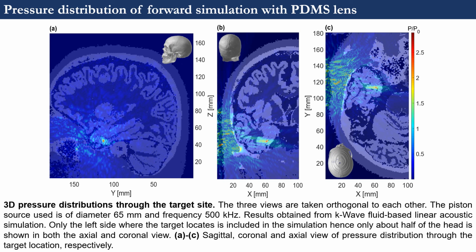Future work will be conducted to validate these simulations through experiments on an ex vivo skull sample.